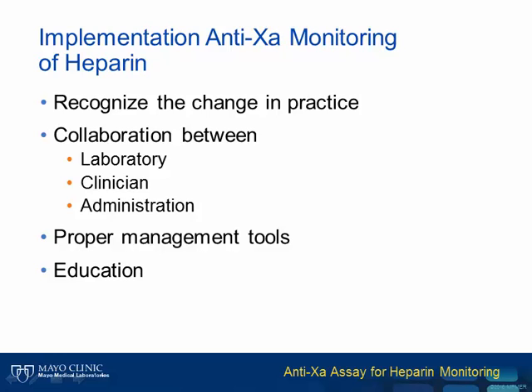Furthermore, a change in practice will have to be reviewed and accepted by the clinicians and supported by the institution's administration. A successful transition will require close collaboration between the providers, laboratory, and information technology to provide the proper clinical and management tools and education.